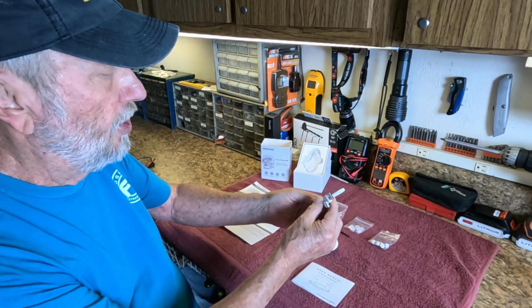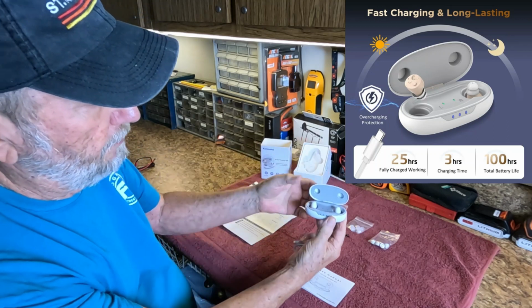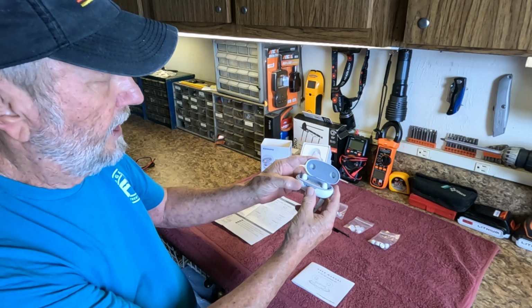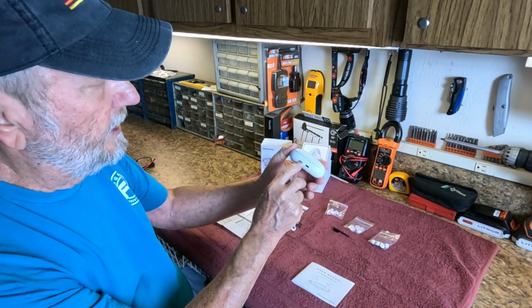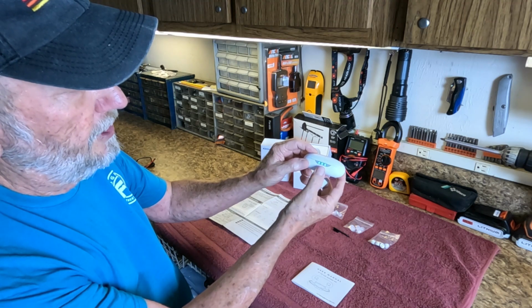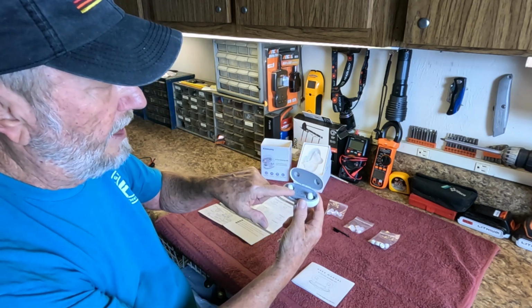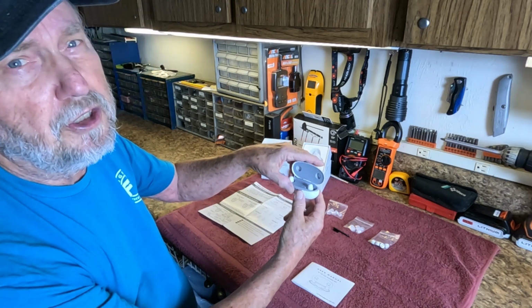Let's go right into the charging of this. And this is the front side. It opens up like this. There's your left earpiece and there's your right earpiece. And if you'll notice, it says left and right. I'm going to cover that in the screenshot. Now on the back, there's a button right here that if you push, it tells you the status. It's fully charged, the case is. And also when you open it up, the two lights are out, meaning both headsets are charged up. If they were green, they would be charging.